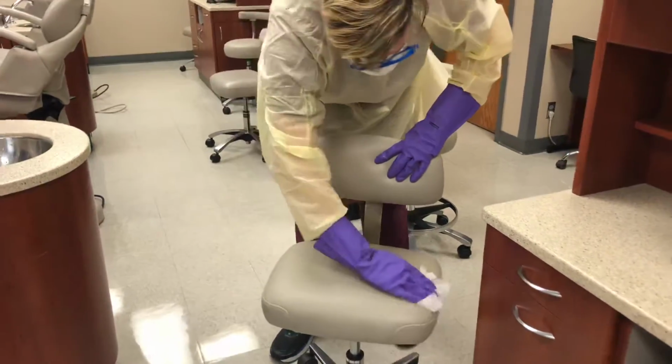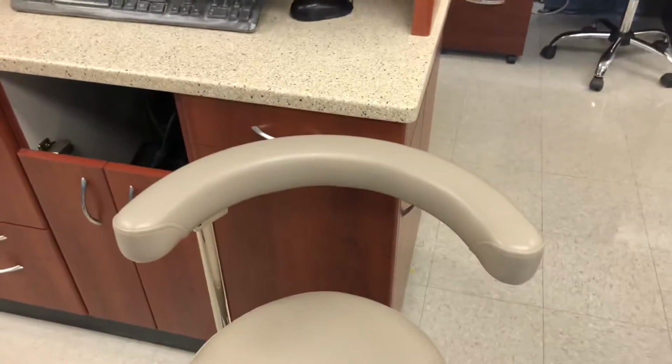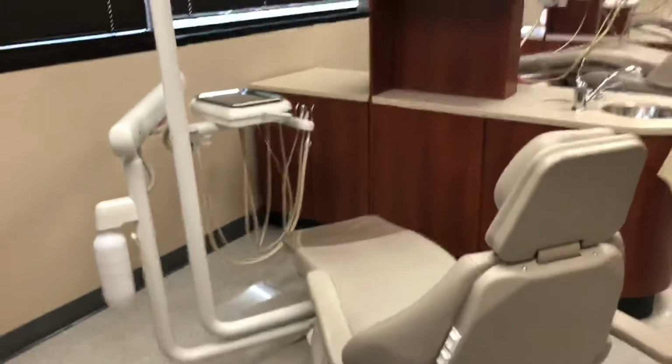This is the clinician chair where he is now. With the arm is considered the assistant chair, and then obviously the patient chair.